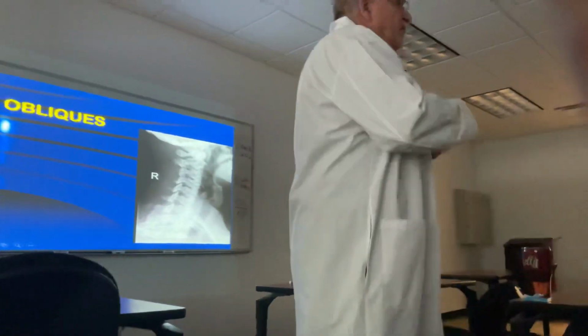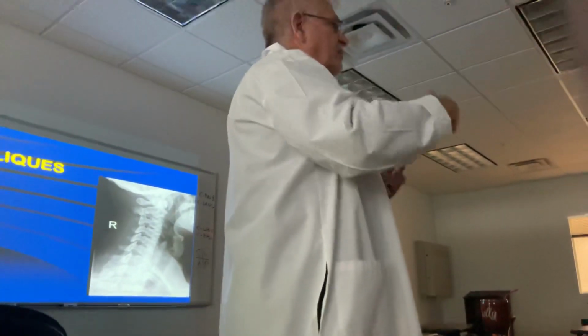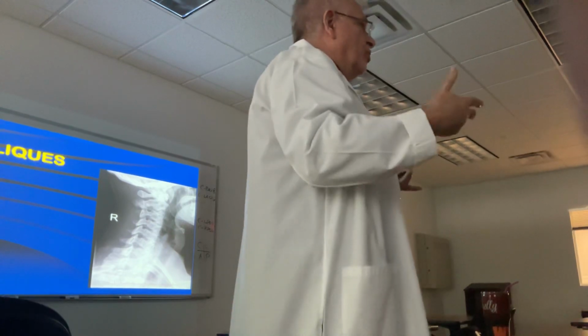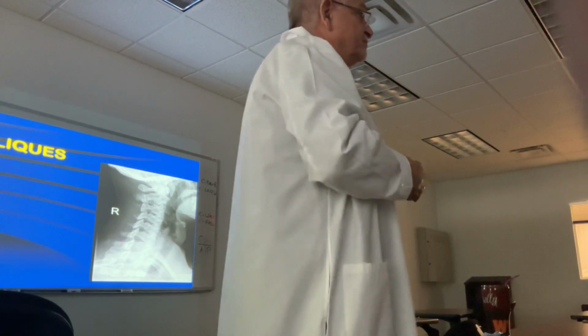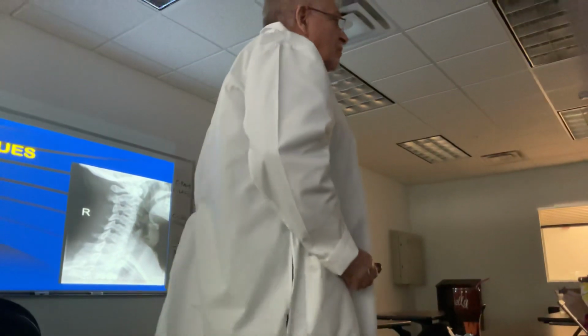What we're trying to do is simplify and say, we're going to follow this standard. Mark the side that's closest to the film and decide whether it's anterior or posteriorly performed. When in doubt, call the office and ask. So if I get this in my office, I will call the office and ask, hey, was this digitally flipped, or is this the correct side?